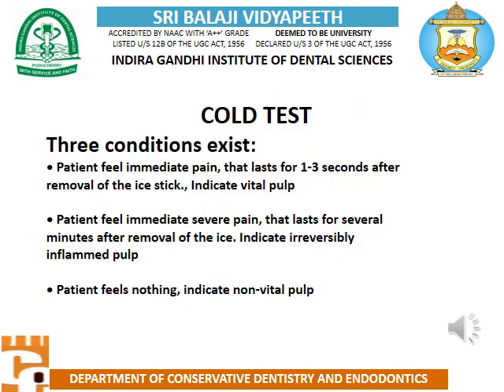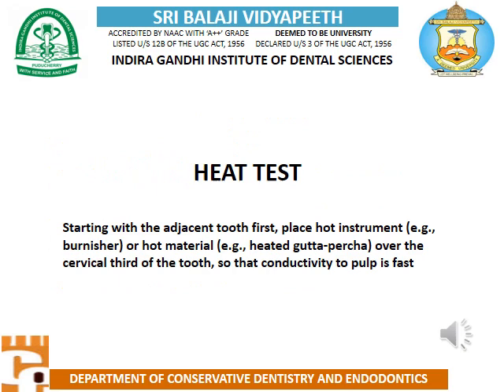Cold test. Three conditions exist. Patient feels immediate pain that lasts for 1 to 3 seconds after removal of the ice stick: indicates vital pulp. Patient feels immediate severe pain that lasts for several minutes after removal of the ice stick: indicates irreversibly inflamed pulp. Patient feels nothing: indicates non-vital pulp.